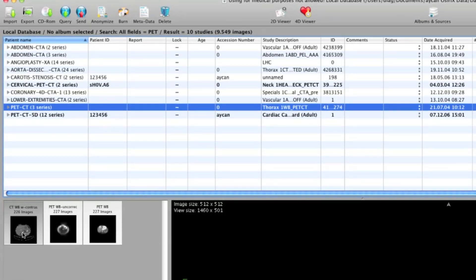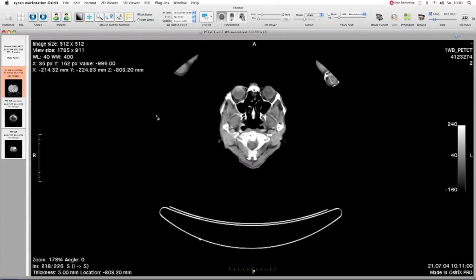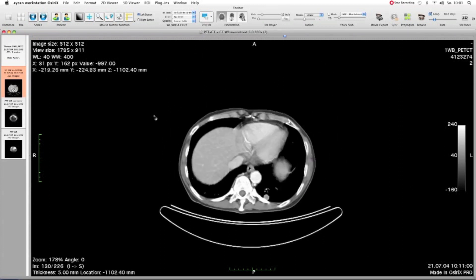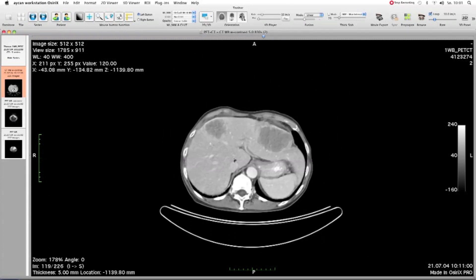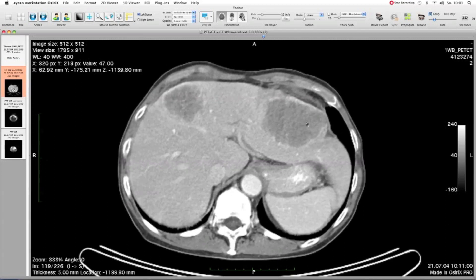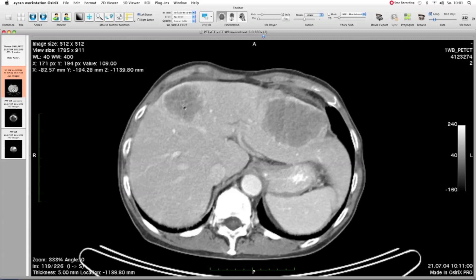There are 3 series: 1 CT and 2 PET. We need the CT series. Please open the CT series with 226 images and go down to the liver. In the liver you can see two big lesions. We want to measure the volume of these lesions. We cannot use the automatic segmentation algorithm because the contrast is too low — it would run out of the lesion and capture all of the liver.